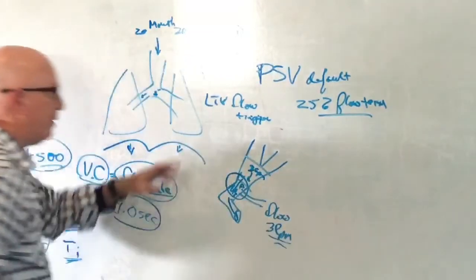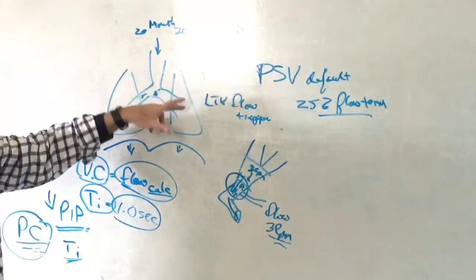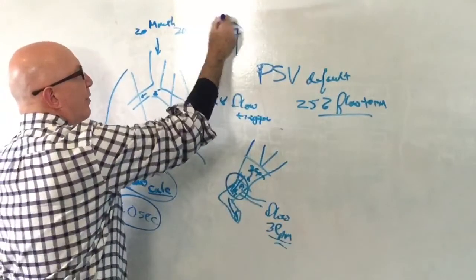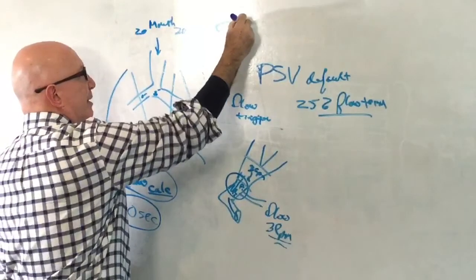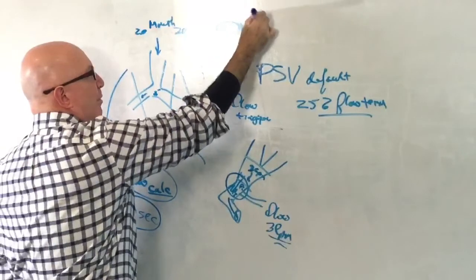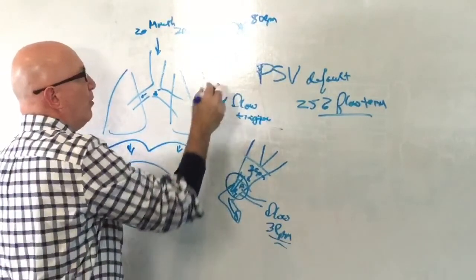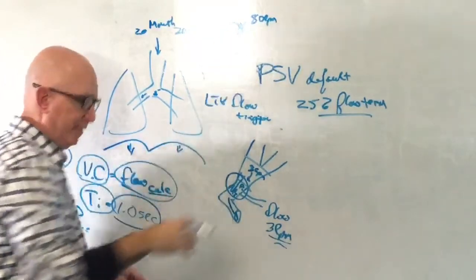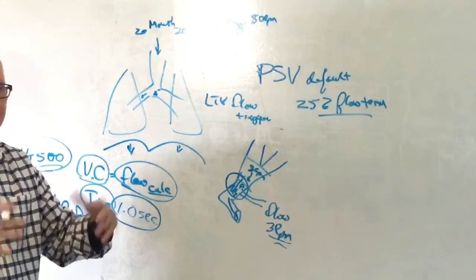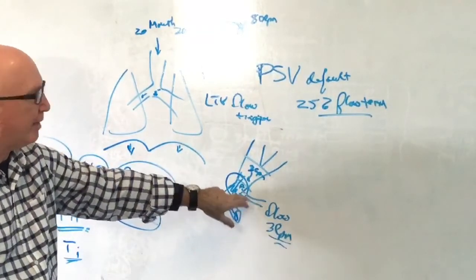And the reason why I'm bringing this up is because it relates to patient-ventilator synchrony. What this termination simply does is that the ventilator knows what the flow was at the beginning of inspiration, or during the inspiratory phase. And so let's say this flow was 80 liters per minute. And what the ventilator says is that when the flow deteriorates, because as the lungs expand, the flow rate down through the airways gets less, which is measured at your flow sensors here, or your pressure sensors in your ventilator circuit.